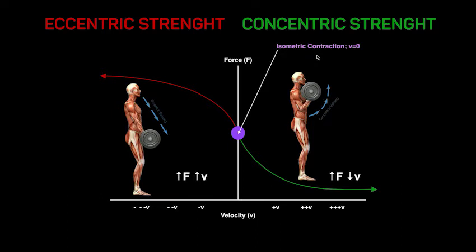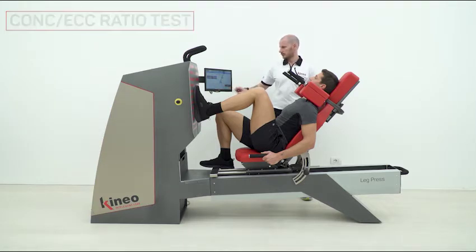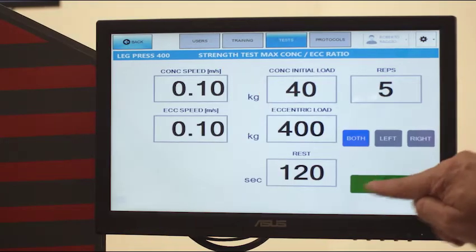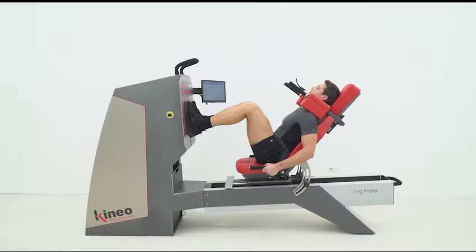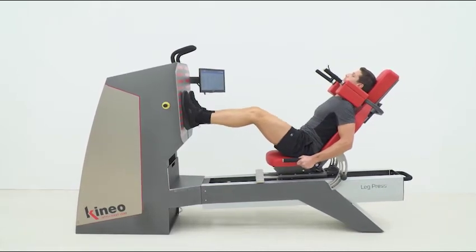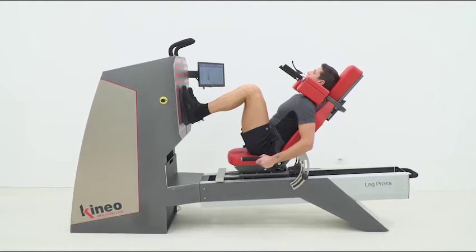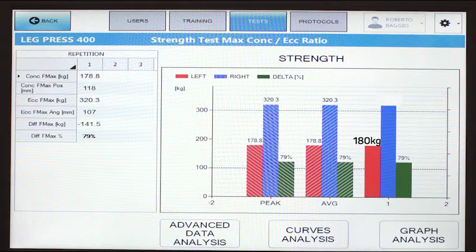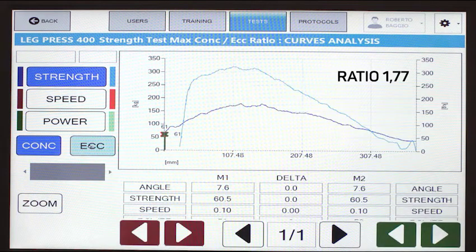Let's check this out right away with the Kineo ratio test. This isokinetic test allows us to analyze the maximum strength in the two phases. Let's set a 0.10 meters per second speed and ask the subject to make a repetition by pushing as much as possible in the concentric phase, and trying to resist as much as possible in the eccentric phase. From the test report, we can see that the subject developed 180 kg in the concentric phase and 320 kg in the eccentric phase, with a 1.77 ratio.